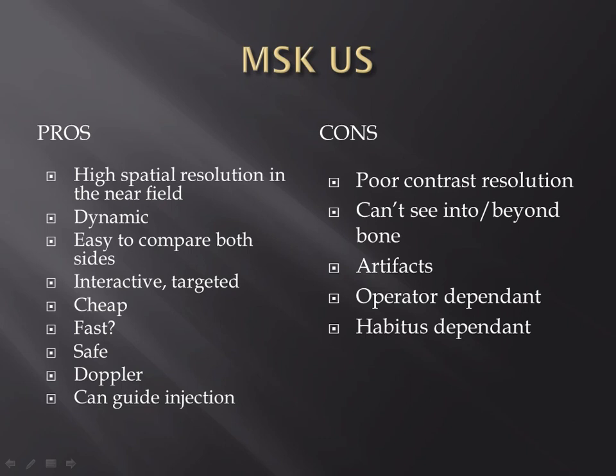But the benefit is you can go side to side, look both sides, normal to abnormal. It's interactive. The patient can tell you where they hurt, when they hurt it, and whether it's better or worse than when the referral was made. Sometimes if you're imaging these people a week or two after the request for ultrasound, their symptoms may have gone away, or they may not, or they may have changed in character.